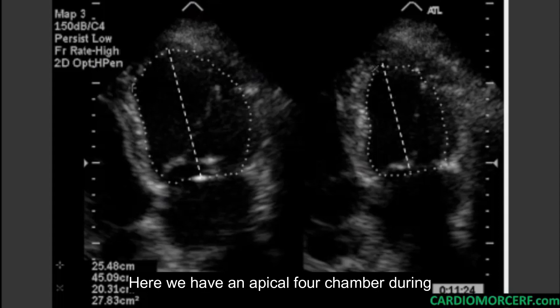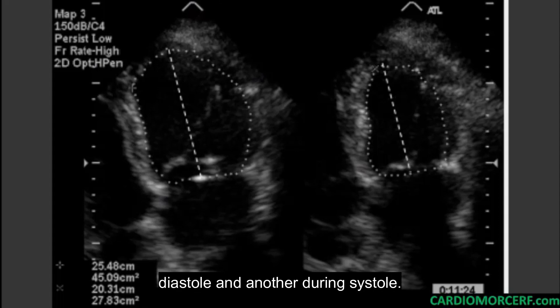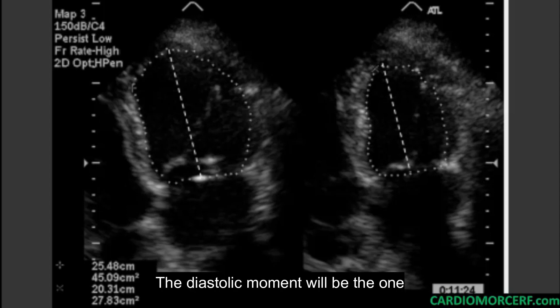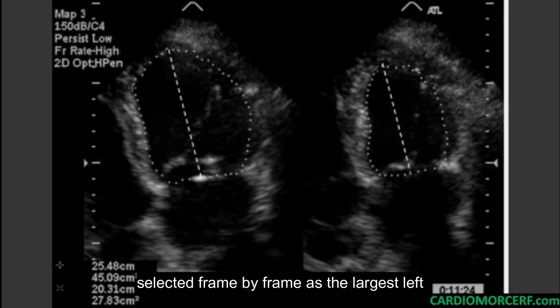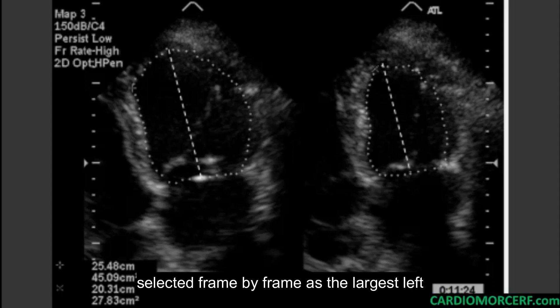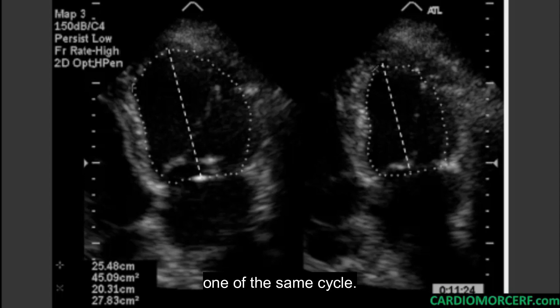Here we have an apical 4-chamber during diastole and another during systole. The diastolic moment will be the one selected frame by frame as the largest left ventricle, and the systolic will be the smallest one of the same cycle.